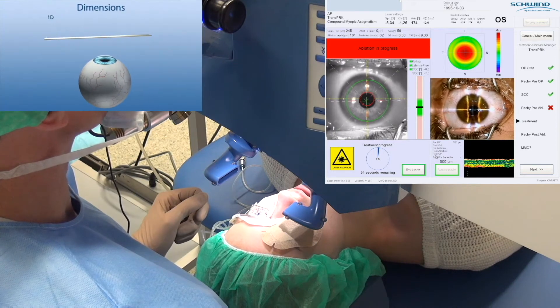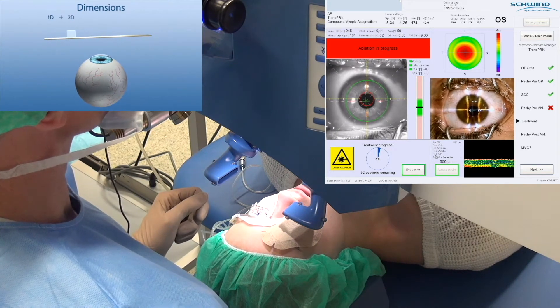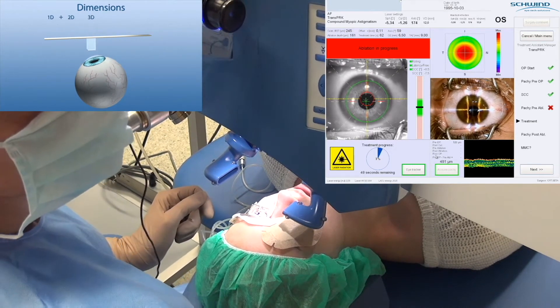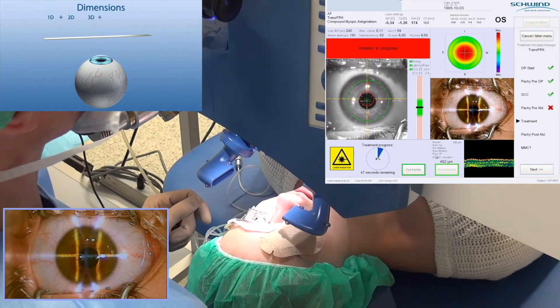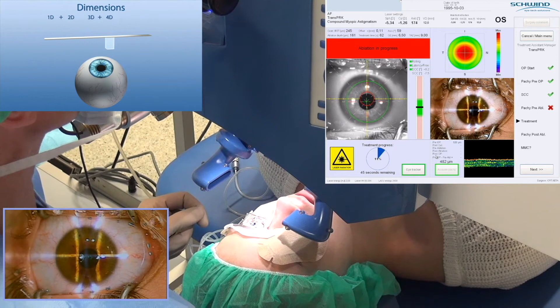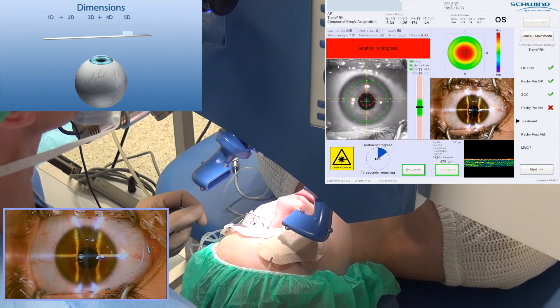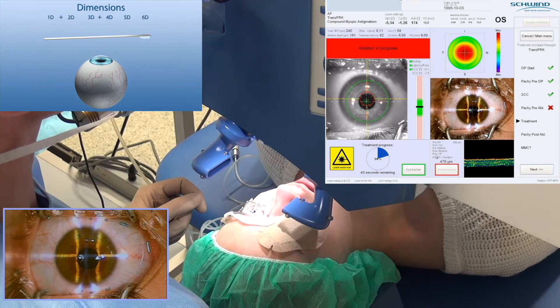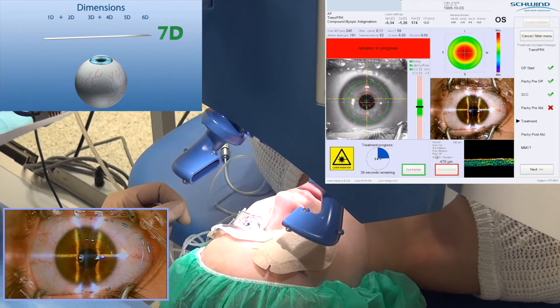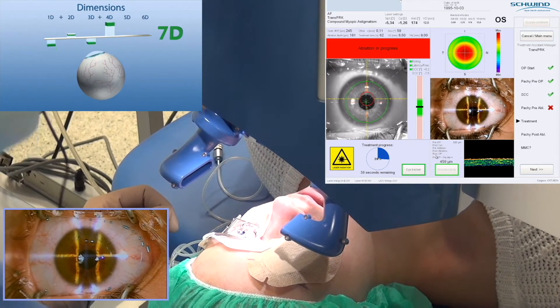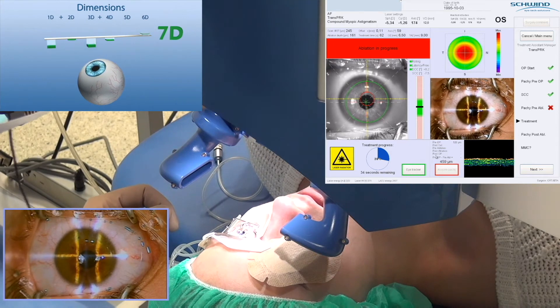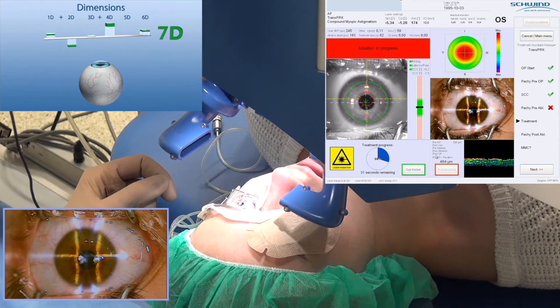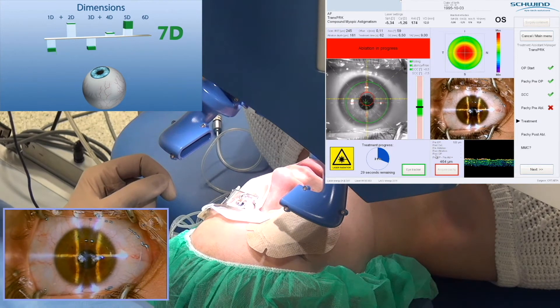The eye tracker camera monitors the position of the eye 1050 times per second. Apart from linear movements, it also compensates rolling movements of the eye. Compensation of eye rotation around its optical axis is achieved with the static and dynamic advanced cyclotorsion control. Movements along the z-axis are actively compensated by means of z-tracking.